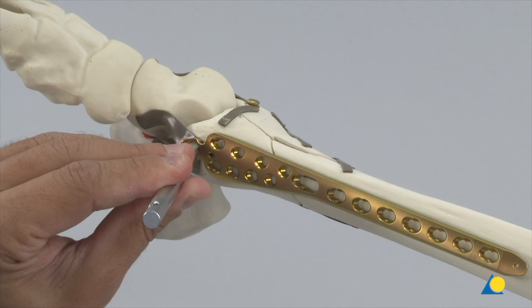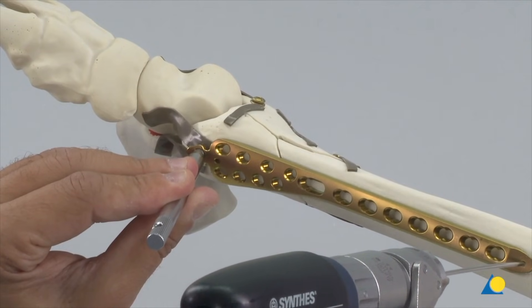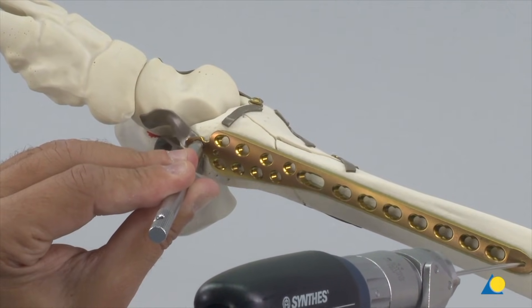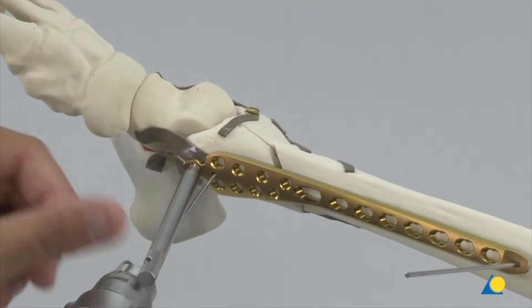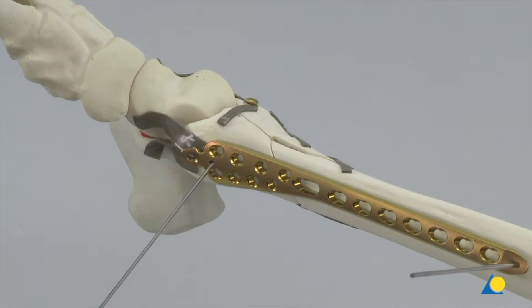A bending pin is screwed into the most distal hole of the LCP to facilitate positioning. The plate is preliminarily held in place with K wires, first proximally and then at the distal end. In the clinical situation, the correct overall alignment of the joint block and diaphysis is checked under image intensification, as the metaphyseal comminution is reduced indirectly.